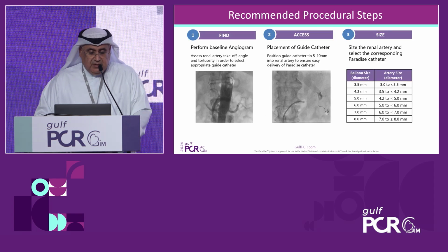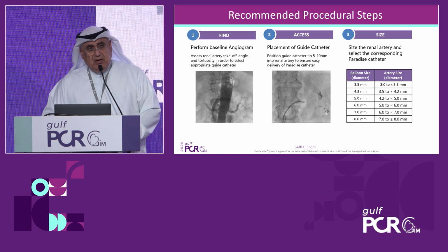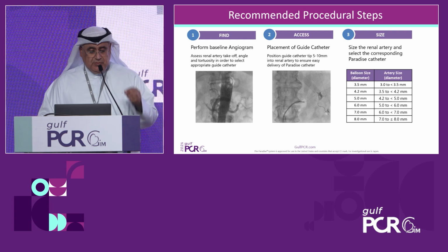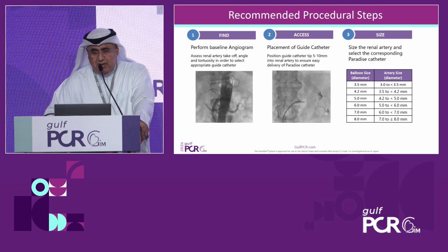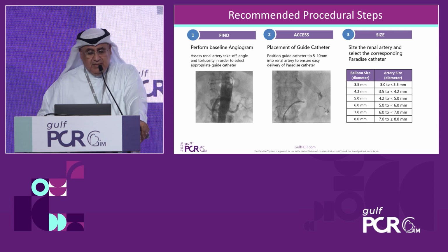Here we can see the arteriogram on the left side assessing renal artery. Takeoff angle is very important, and the tortuosity, certainly the accessory arteries. And this is really challenging for us, even as experts in the coronaries. We face sometimes challenges by accessing those renal arteries. It's not easy. I wish to have some kind of radial approach for those cases, but yet we don't have that.